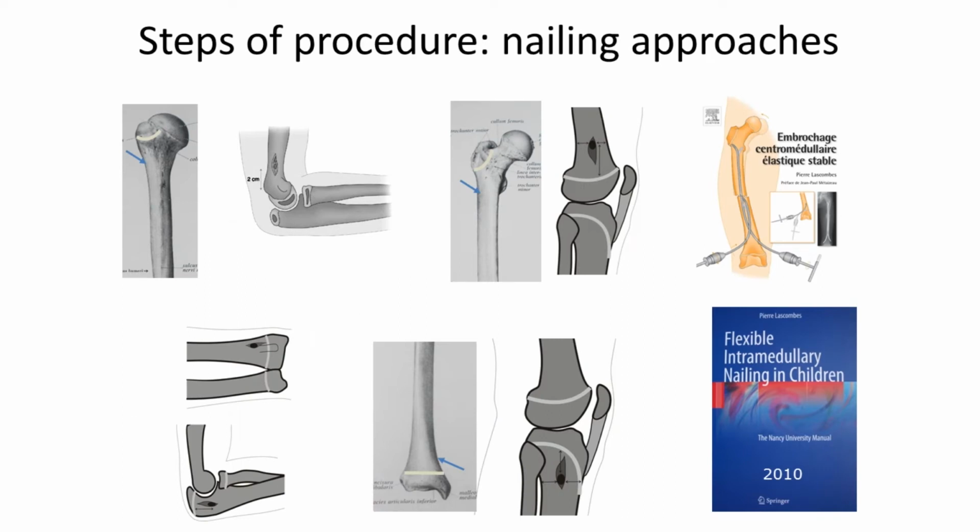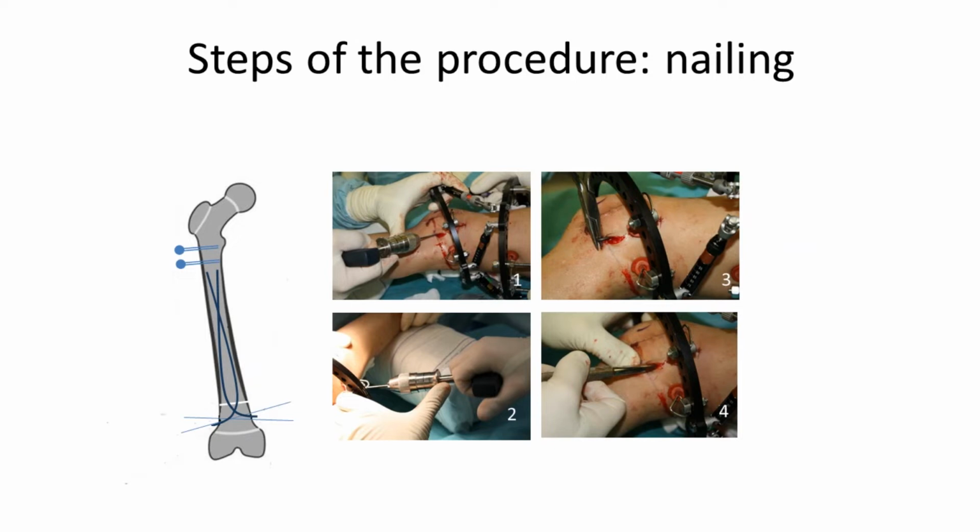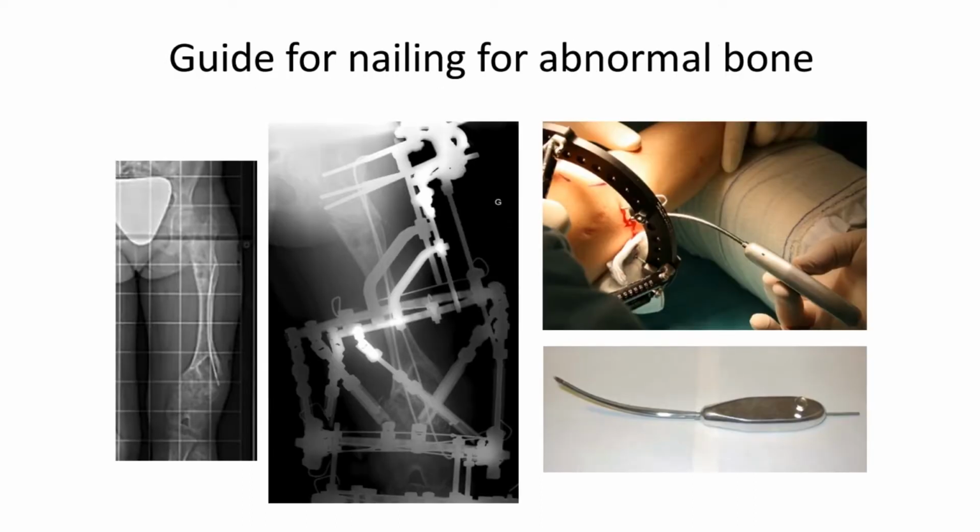percutaneous technique. For intramedullary renailing, 2 entry holes are made at the metaphysis level with an awl in an oblique direction towards the osteotomy site at the distance of 20 to 30 mm from the growth plate. Then 2 precurved nails are inserted through entry holes up to the opposite metaphysis one by one, using the handle, for example. If needed, we use a special curved guide with a slot to place into a bent nail to insert it throughout chondromatosis or fibrous lesion following required trajectory. When pathologic tissues are passed, the handle may be used for nail insertion.